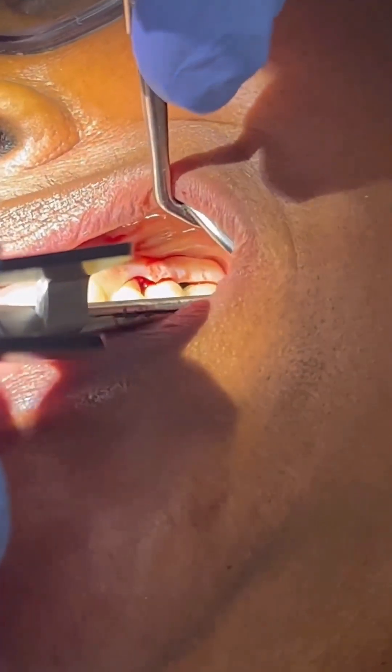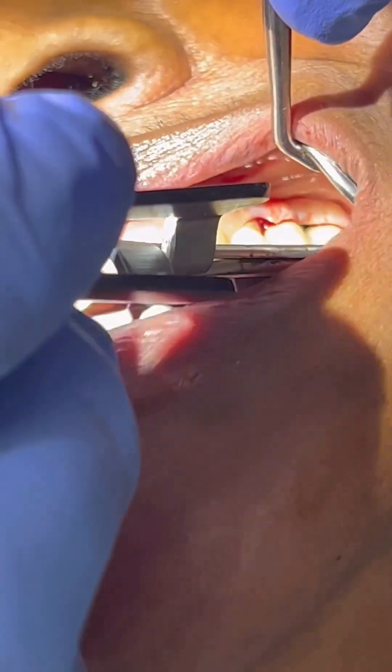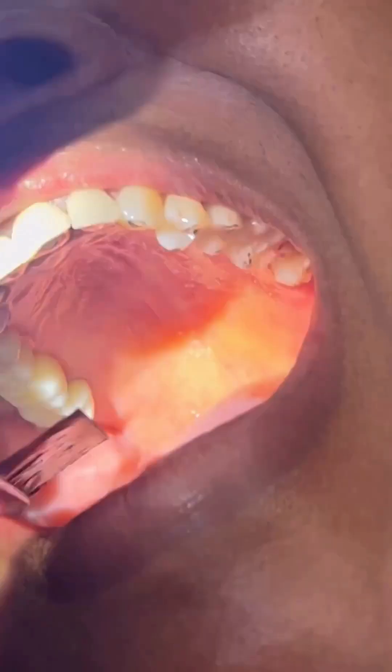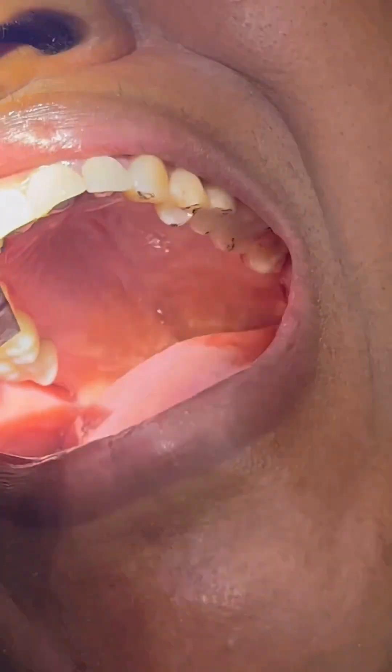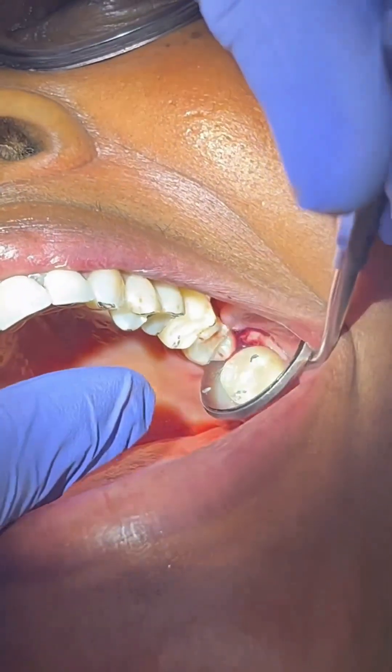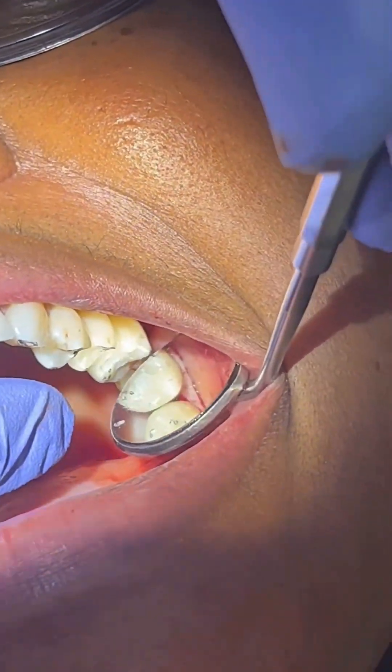Tap, tap, tap. Chew like a piece of gum. Open. Bite down. Bite and hold it. Open. Great. Just a little adjustment and some excursive movements there.